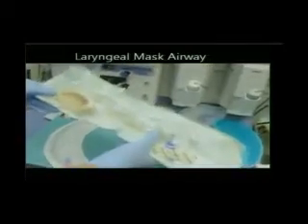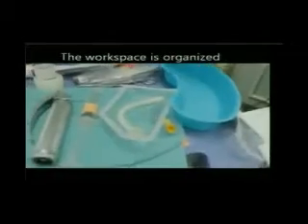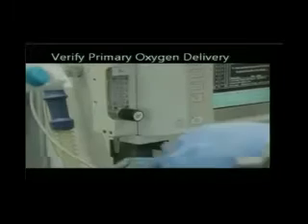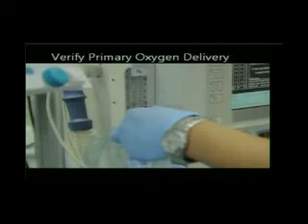So this is placed, and he's just verifying that he has the unit here and that it appears ready to go. So I mentioned everything is organized. That may sound silly, but it's actually really important because when there are problems, you have to respond in anesthesia in a matter of seconds. You have to know where things are. It has to be set up. If you have to walk even a few feet and the patient's not getting oxygen, it's a few feet too far. So everything is placed where you know exactly where it is. And you can grab it literally in a heartbeat, to have that instantly available for the patient.